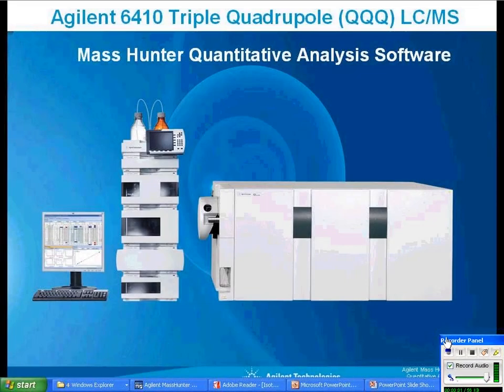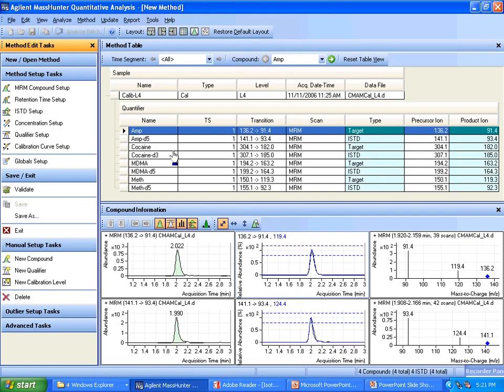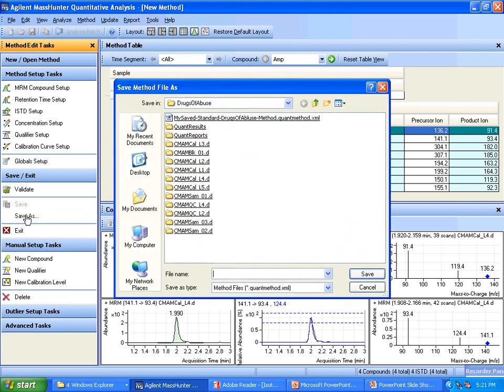Let's talk about how you can manage your method in terms of saving it and loading it. Now, if I look at the method editor and I've created a method, this is the drugs of abuse method, I can save that method and give it a name. I'll just call it DOA.